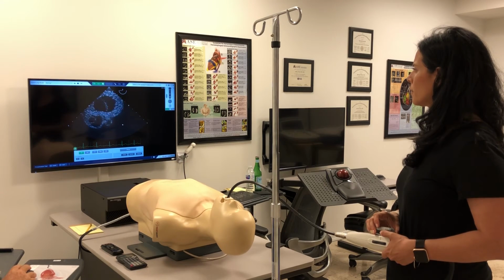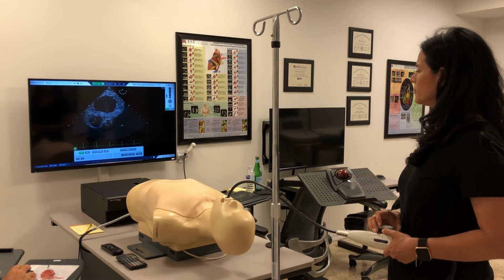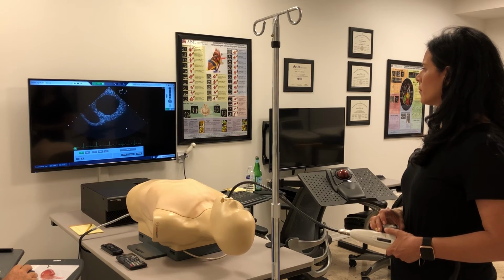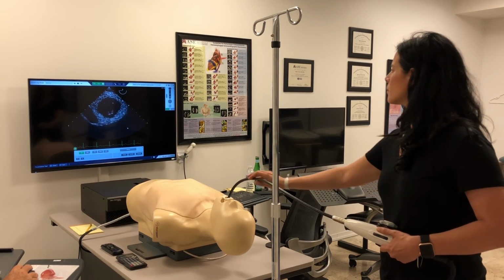That's pretty good. That's nice. So this is the basal short axis view, still called a transgastric view. The anterior leaflet's on the left screen. The posterior leaflet's on the right screen. Good. Now let's go back to the mid short axis view and develop the derivative views.